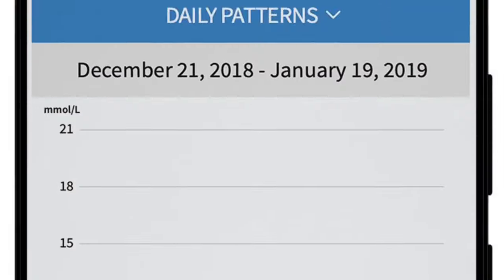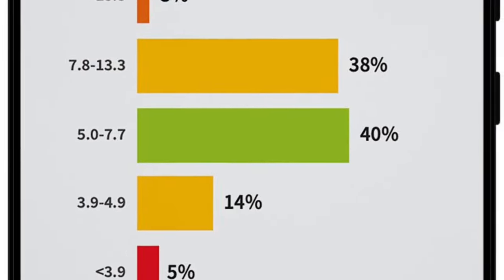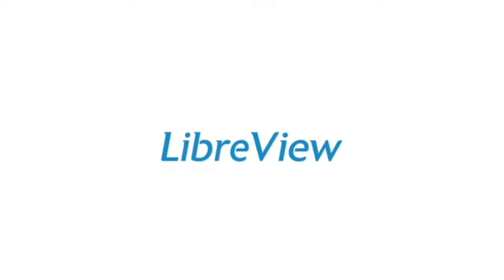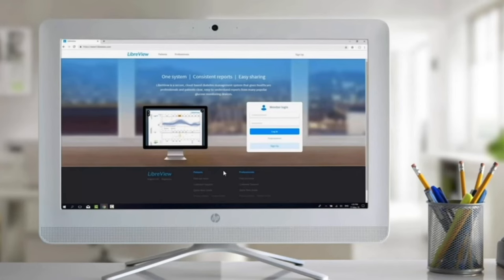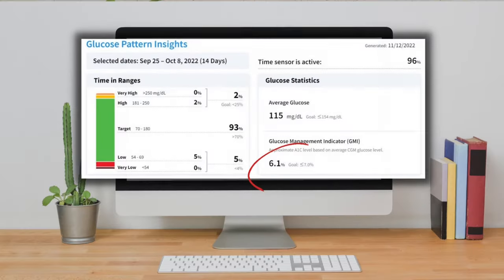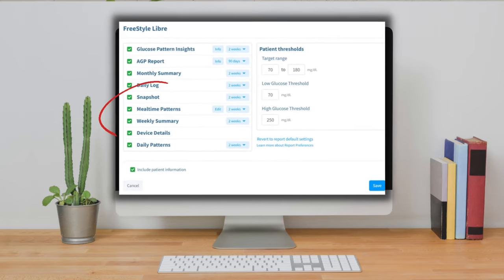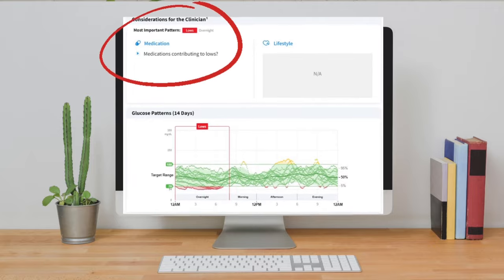Number three: more data. The Libre app already has a ton of information built right into it — graphs and charts, time in range, average glucose levels, etc. But if you want even more data, which most diabetic users typically do, you'll want to check out LibreView.com. Once you log in with the same login you use to access the app on your phone, you'll have access to a ton of extra data that just isn't available on the app: things like estimated A1c, options to view mealtime patterns, daily patterns over specified periods of time, and even trouble areas the system has noticed for you to work on. It really has a lot of invaluable data that I use myself all the time to try to improve my current glucose levels.